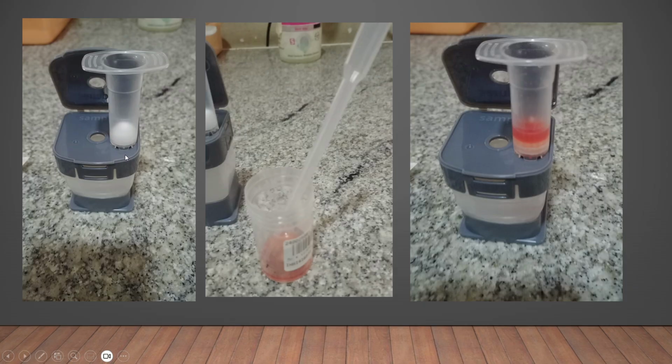Don't do that, because you may suck the reagent from the chamber into the syringe. So to prevent that, you always pull the piston out first and then put it here. Not in the center, in the side one. So using the Pasteur pipette, from the sonicated sample, you put the sample over here.